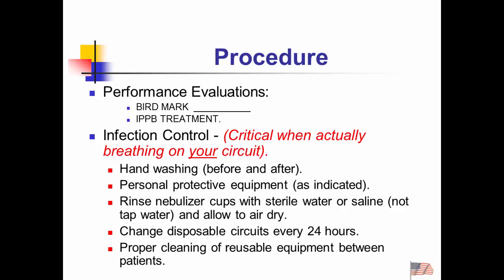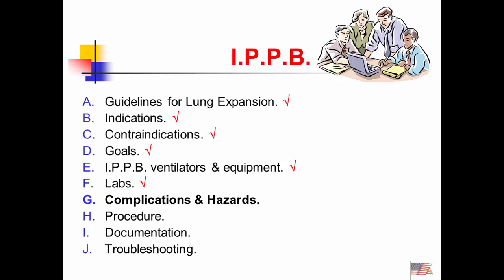So for your performance eval, again, we're probably going to be using the Bird Mark 7 or Bird Mark 8, and you're going to be giving a treatment. I believe, Amber, is that correct, that they do it on us? On test lung, okay. So we won't be using anything in the nebulizer cup itself, because I don't think my test lungs need to have saline put into them. But just some of the things that we end up using as far as that, rinsing those cups out.